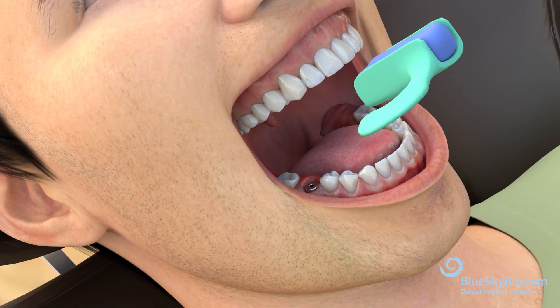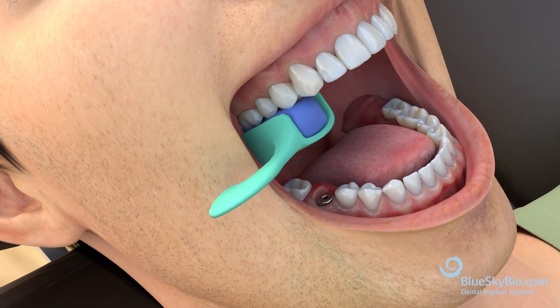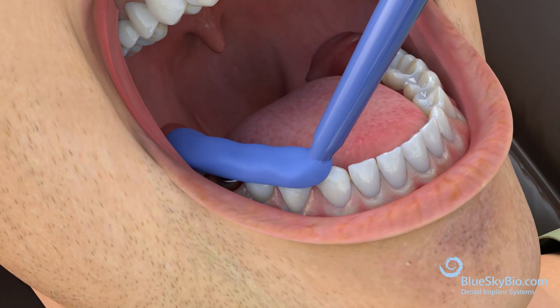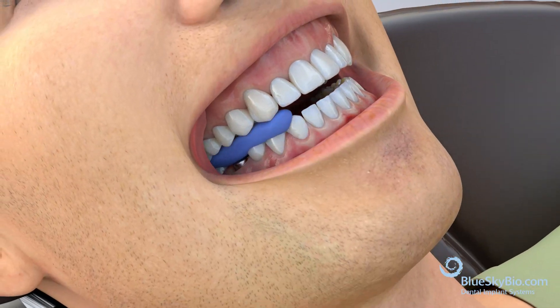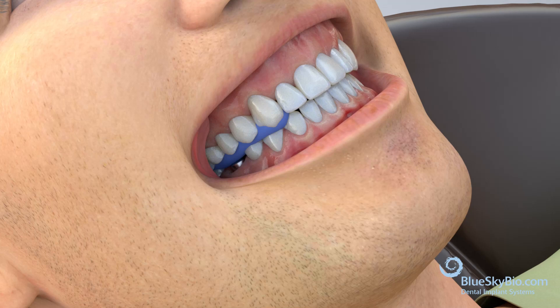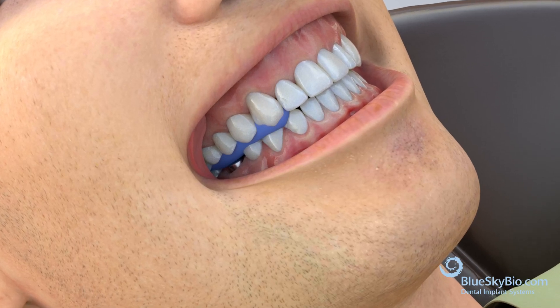Take an impression of the opposing arch using a posterior tray. Apply bite registration and make sure the patient is seated at a right angle. Apply bite registration material on the occlusal surfaces of the mandibular teeth and instruct the patient to bite until maximum intercuspation is achieved.